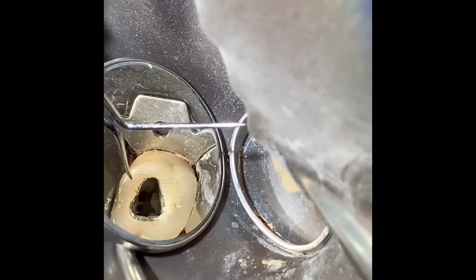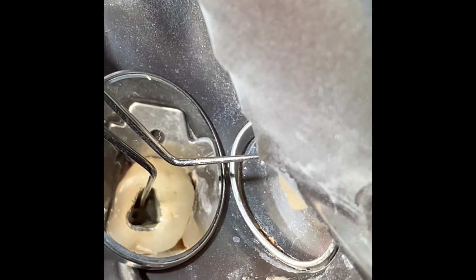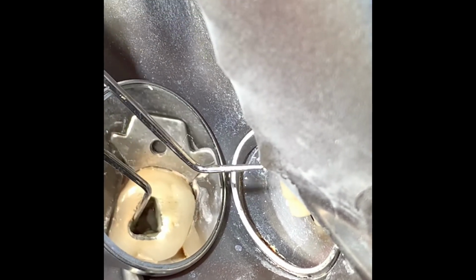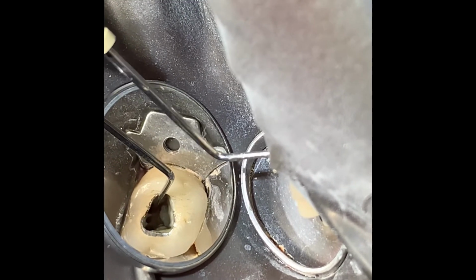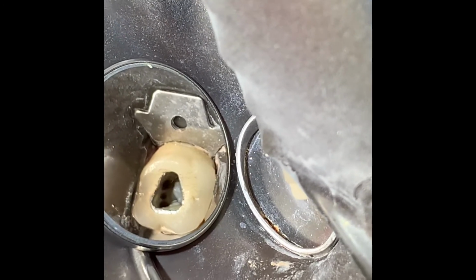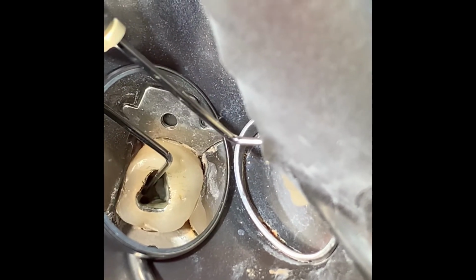She has some symptoms, and we opened the tooth up, and lo and behold, there was a missed MB2. Well, she had found MB1 and MB3, thinking that MB3 was actually MB2. But she missed the actual MB2, and I don't know if you can see it, but now you can see the MB2 right there.